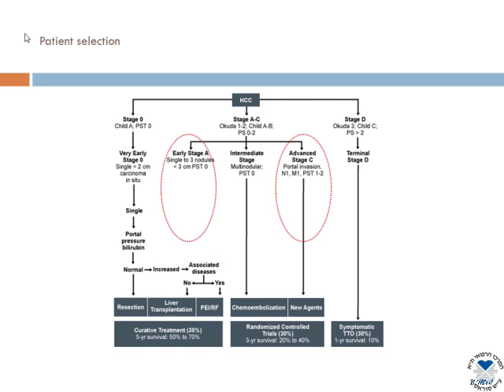The stage A group is basically patients who are intended for curative treatment as well, but sometimes TACE can be helpful there, for example in RF procedures where the lesion is unreachable. On the right, how about advanced stage C patients? Are we pushing the limit? Yes, we can do TACE for large tumors. We can do TACE for portal invasion, which 10 years ago was considered to be a contraindication, not anymore.